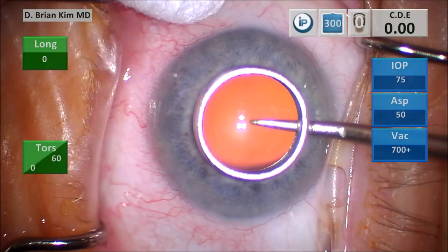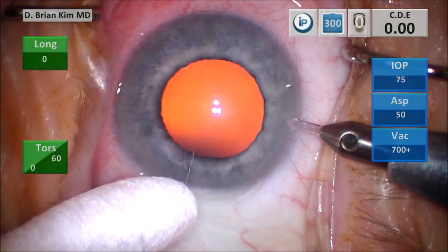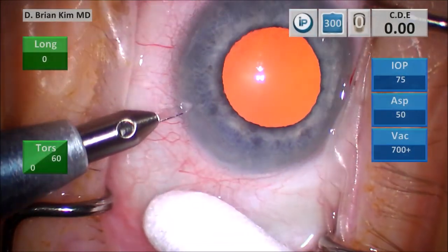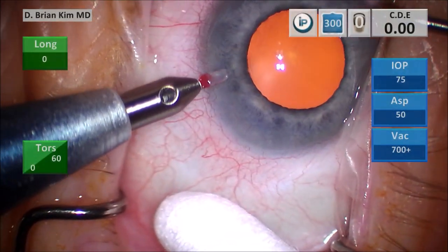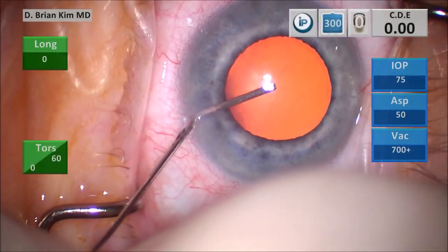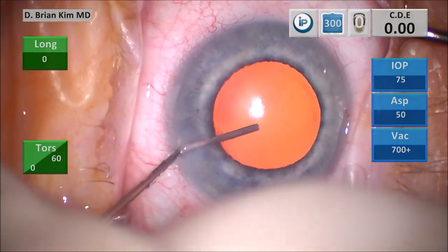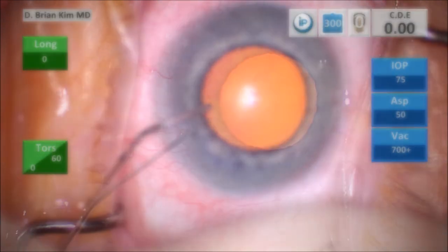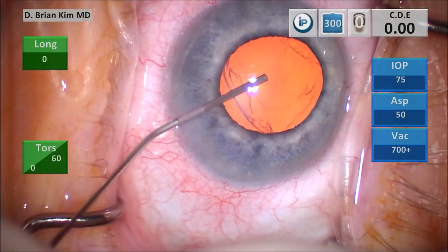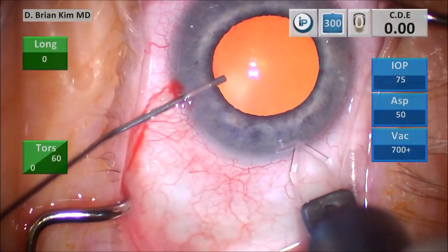I use the corneal mark to help me center and size my capsulorhexis. I use a cotton tip to turn the eye so I can make the blade flat and parallel to the iris plane, creating that corneal shelf. By doing this, I can ensure a self-sealing corneal incision. I'm injecting lidocaine and epinephrine, going around circumferentially, making sure that the epinephrine is contacting the iris well. I'm using dispersive viscoelastic to viscodilate the pupil. Using the cannula, I hold the eye so I can do my triplanar corneal incision.